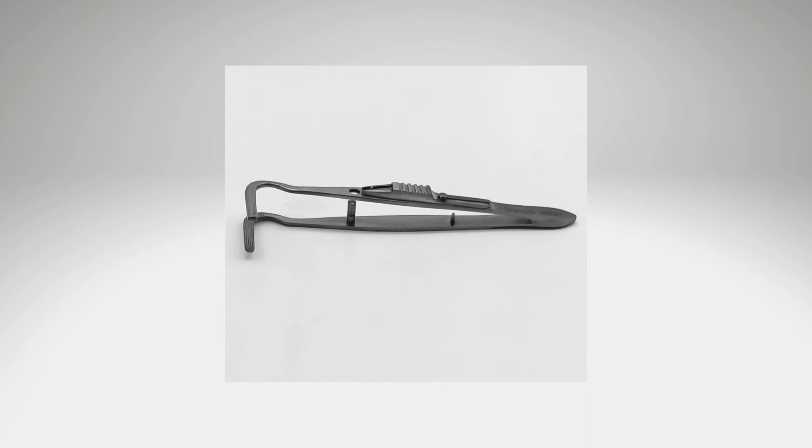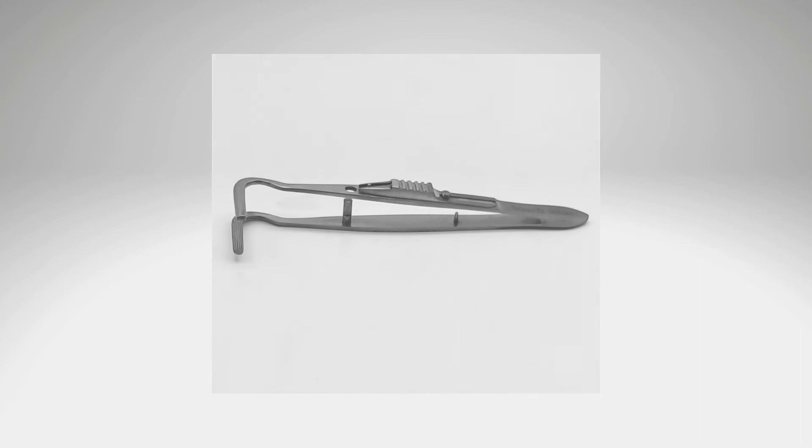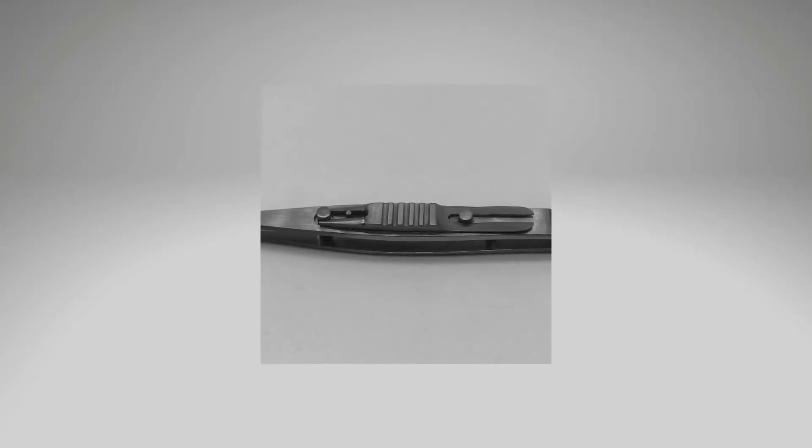Corrugations are arranged parallel to the long axis of the blades to prevent slipping of the muscles. The corrugations are fine and reciprocal to prevent muscle damage. A sliding attachment lock of the blades helps in the secure locking of the clamp to prevent the slipping of the levator muscle.